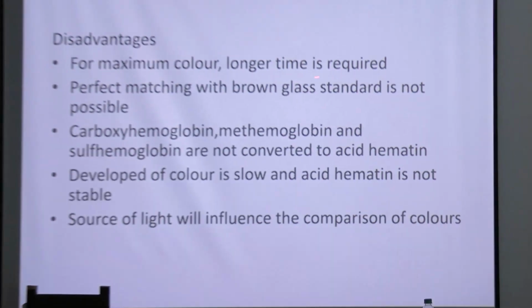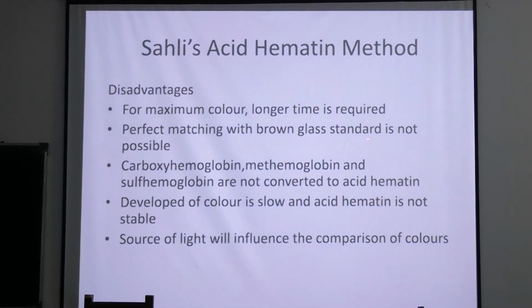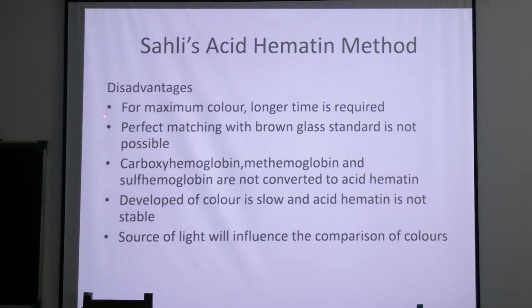Now, the disadvantages: for maximum color, longer time is required. Perfect matching with the brown glass standard is not possible. You do it by colorimetry, just see and compare. So, there will be human errors.